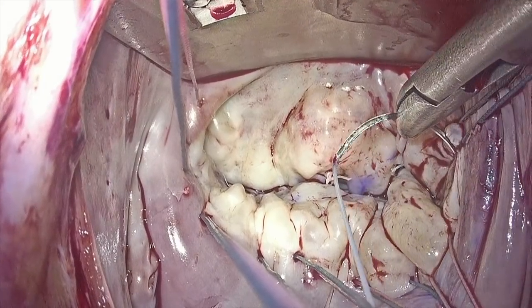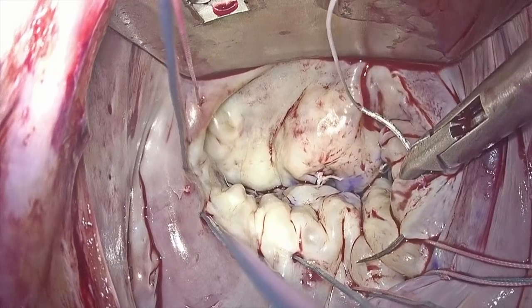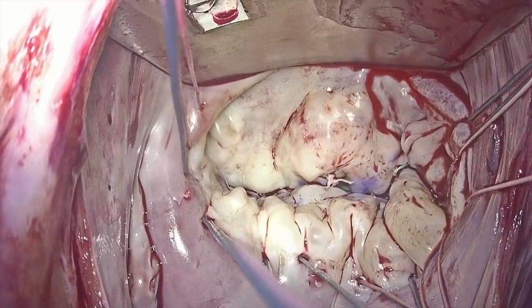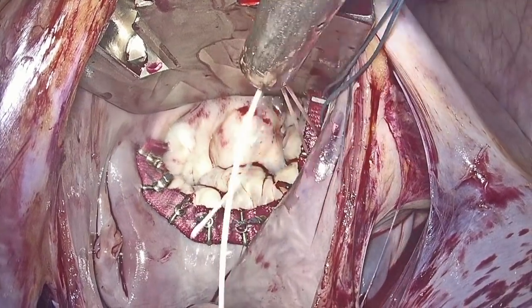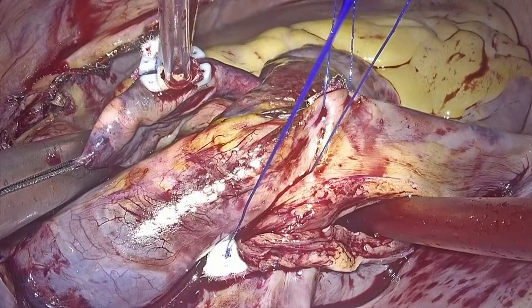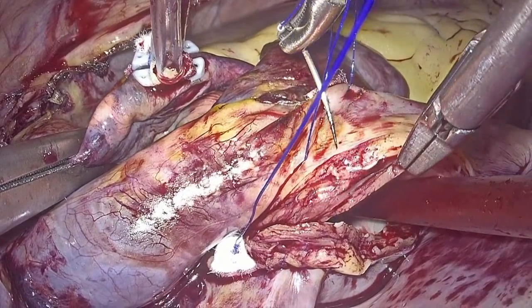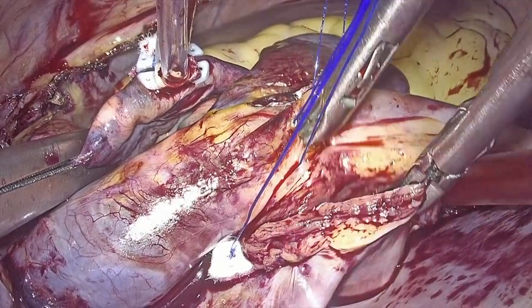Finally, we performed the posterior leaflet annuloplasty with a custom made band made out of Dacron and titanium clips, and we secured the sutures over the titanium clips with the Cor-Knot device. We performed a two-layer closure of the left atriotomy, the first layer being a horizontal mattress and the second an over-and-over suture.